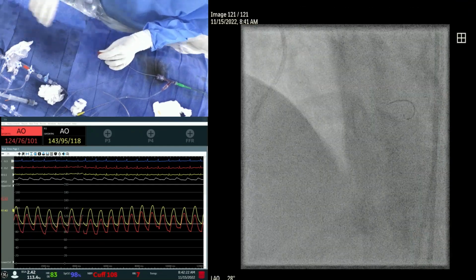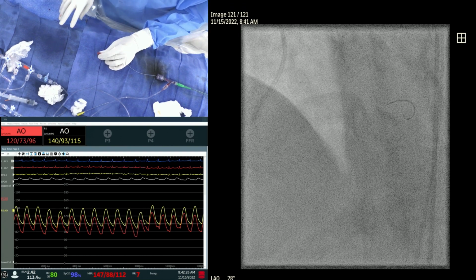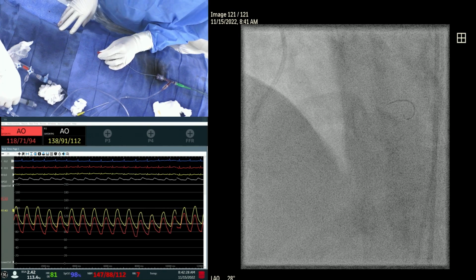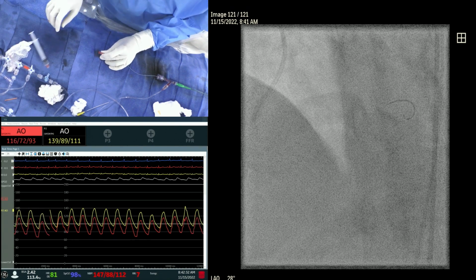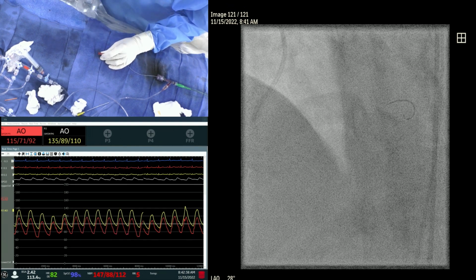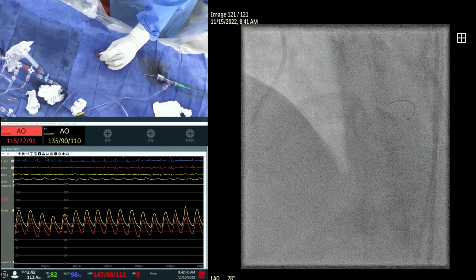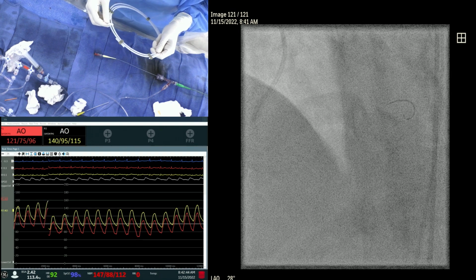What do you need? Get me a new Miracle 6. Yeah, that's not doing the job. Thinking. So we are going back to the Miracle because the tip of the other one was a little more destroyed, was more angulated.